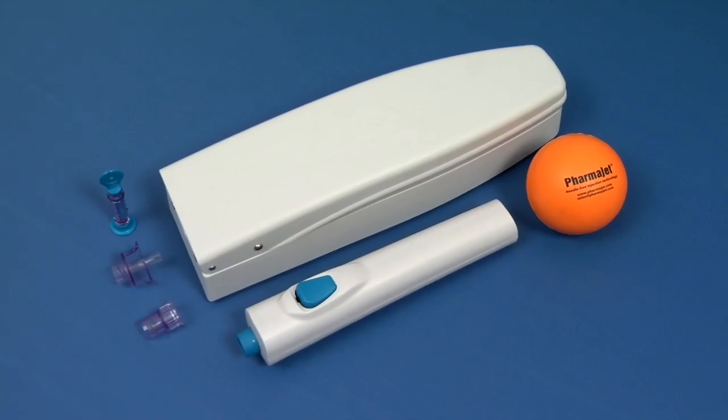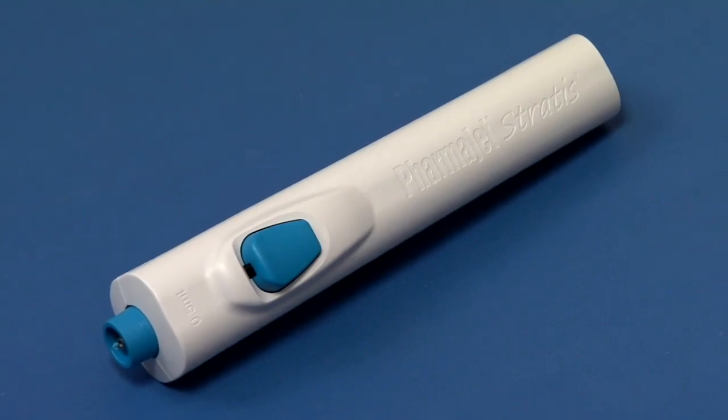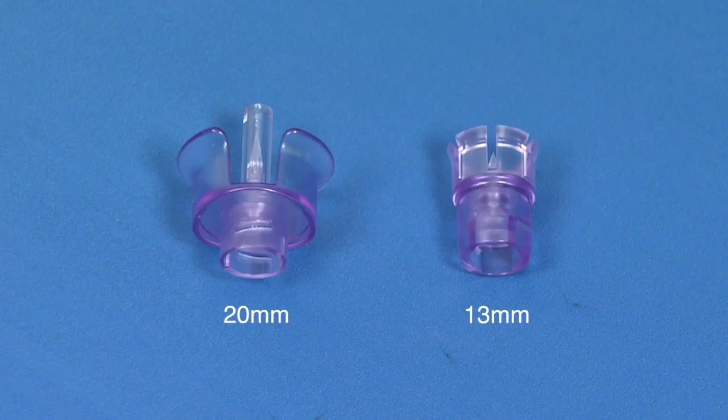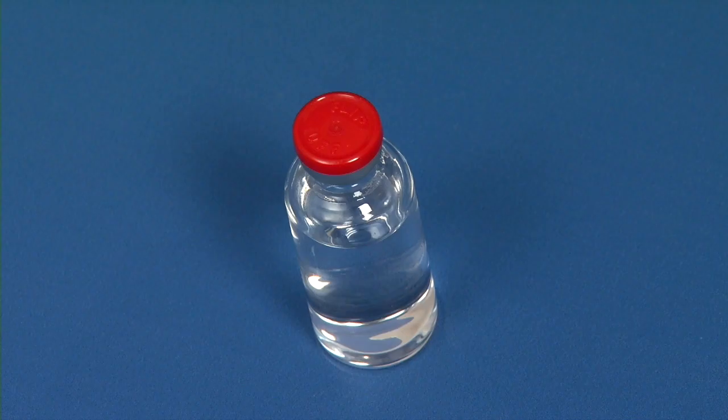You'll need the following materials for this Stratis educational video: PharmaJet Stratis injector, reset station, vial adapter, needle-free syringes, rubber ball, vial of non-sterile saline for injection into the ball.